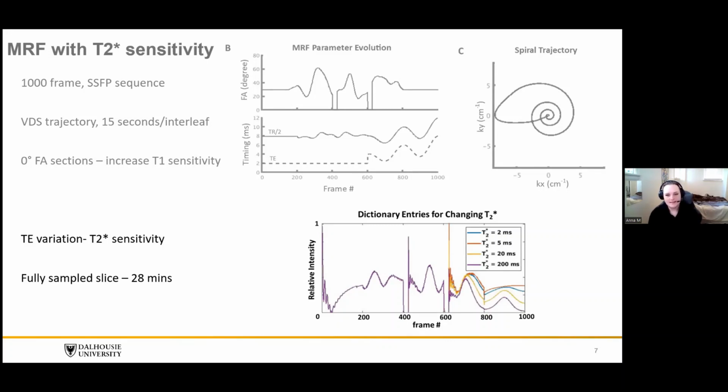But it should be noted that this is still probably highly undersamplable. And so our first task is to check how much of this data we didn't need to still provide accurate parameter maps.